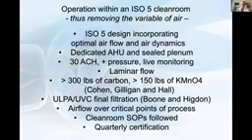We followed all the leading suggestions and publications, again, some by Jacques Cohen, Antonia, Jerry Hall, Tim Schimmel, others, and some leading recommendations from the biopharma industry. We had a dedicated air handler, sealed plenum, 30 air changes per hour, which turned out to be a little bit too high for IVF applications. We ended up adjusting that down. We had about 450 pounds of molecular media split between carbon and potassium permanganate. That's an enormous amount of VOC remediation media.